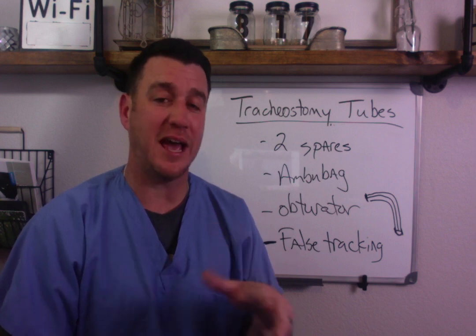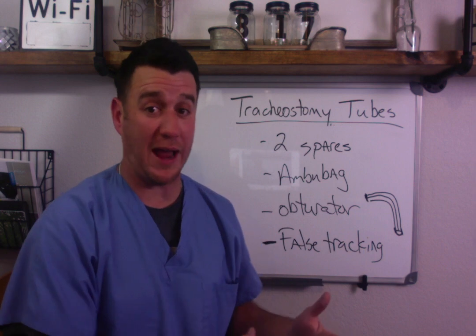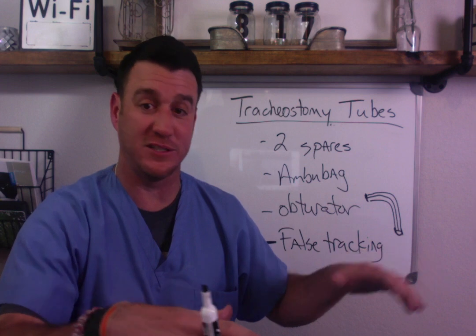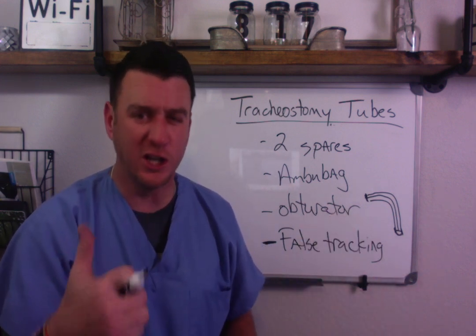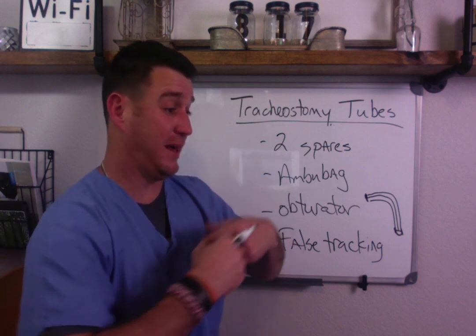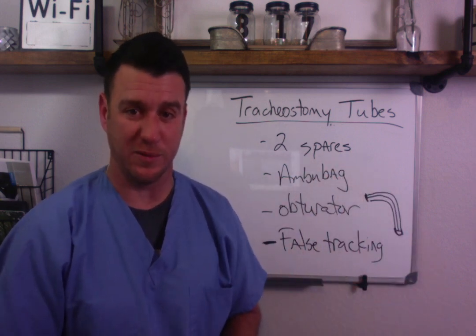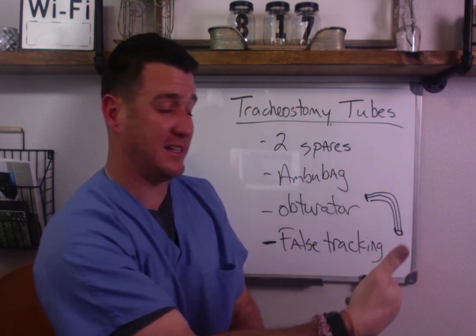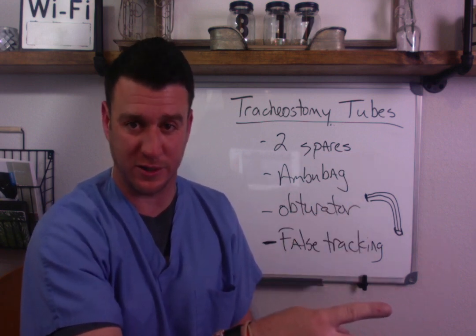But it's your job to ask yourself, am I in the airway? If you false track and you start to bag, you're immediately going to know it because you're going to see subcutaneous emphysema develop immediately. So ask yourself, am I in the airway? A good practice to get into, just like when you intubate a patient, would be to, if I need to replace a person's tracheostomy tube, maybe I should have an end-tidal CO2 detector with me at that time. So I go into the airway, I check for my end-tidal CO2 return. If you're false tracked, you won't get end-tidal CO2 return.